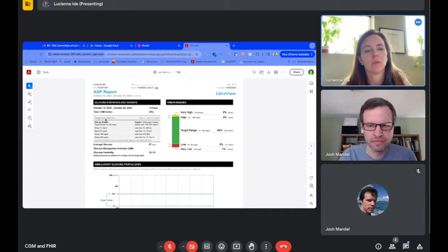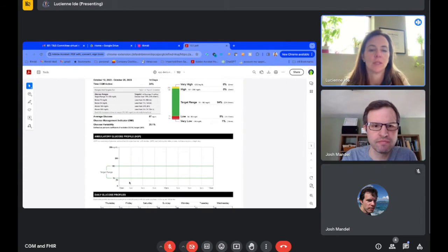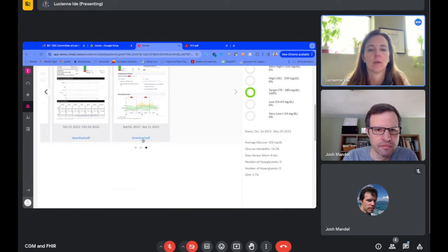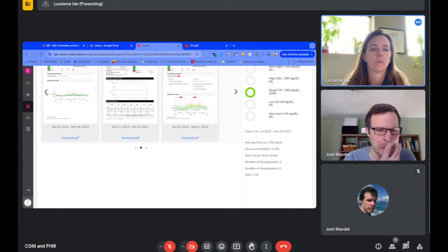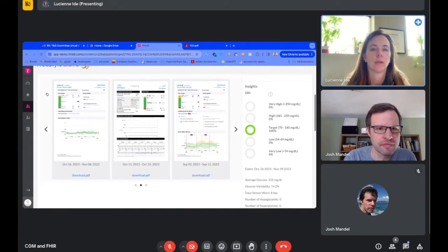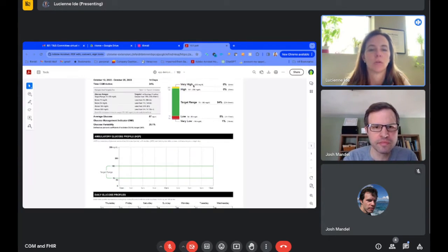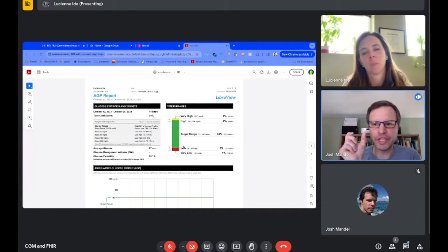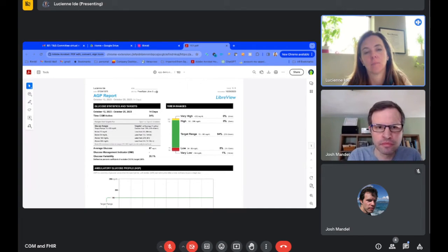And so, they're visually summarizing it here. Everybody has a very similar visual. Yep. You would usually see, let me see if mine had any older data that actually had it better. Anyway, we could pull up a different patient, but you get the picture. Usually it would have a graph here of the data as well. And they give you basically one of these for each 2-week sensor that you wore. Exactly. And then this is the discrete data that they also make available through their API.